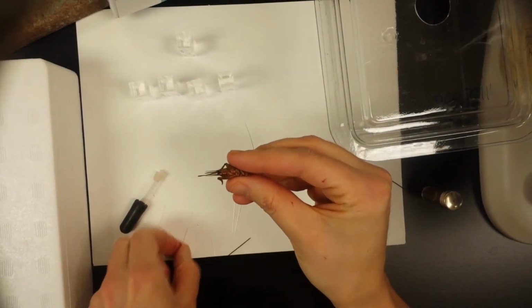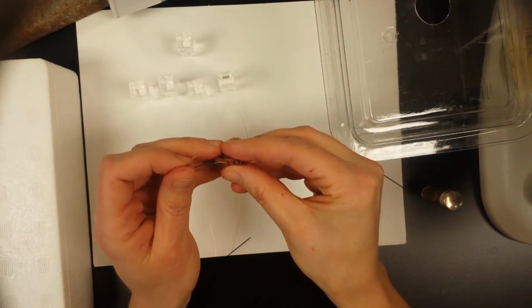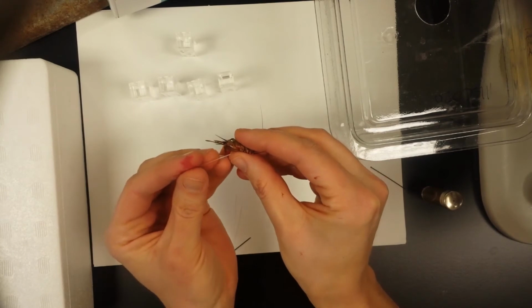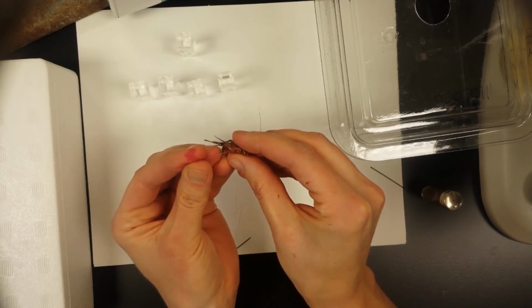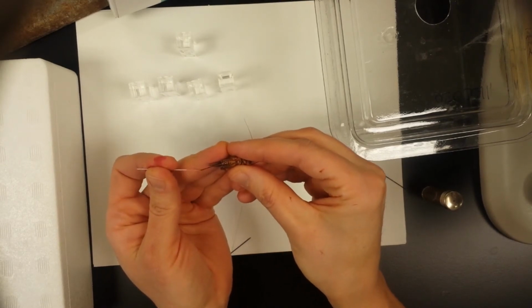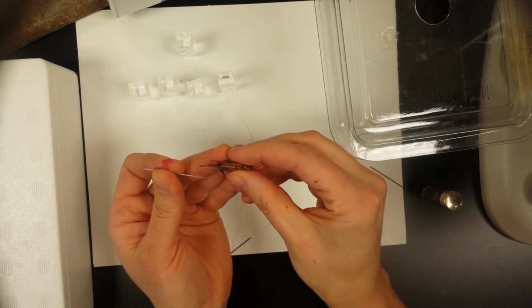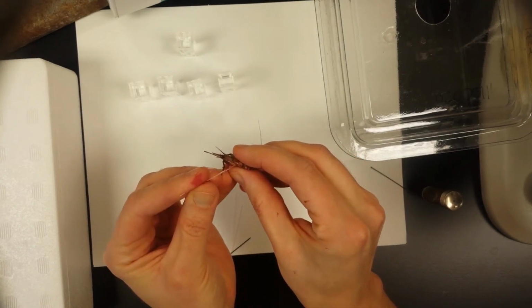Okay, you can actually see it's a little pink in color. So I've got a little bit of hemolymph. I'm just going to rock her around just a little bit to get a slightly larger sample there. I put the microcapillary up against that, so it's going to start collecting hemolymph. I'm going to need a little bit more. Let's see if I can get more. Maybe not in this case.